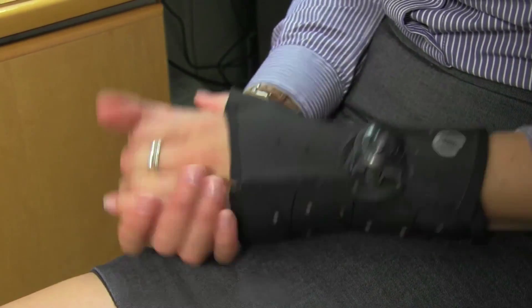Having a painful limb does significantly impact on people's confidence — they're anxious about provoking their pain — whereas this wrist brace does very effectively appear to manage that. It's a fantastic relief because I've actually found confidence at last. Just maneuverability, transferring from car to my chair, being able to put a bit more strength into my everyday workings. It has given me more confidence because it's supporting my hand the way it should, and it also enables me to continue life day to day and my normal activities.